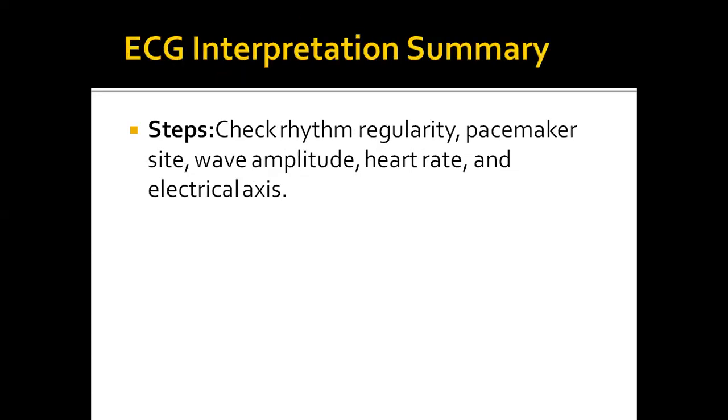ECG interpretation involves several steps. Check rhythm regularity. Identify the pacemaker site, analyze wave amplitudes, measure the heart rate, evaluate the electrical axis. Following these steps ensures a thorough assessment.